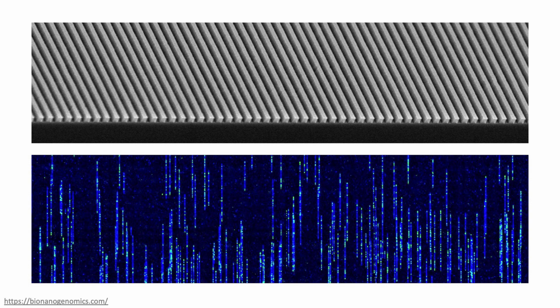And the idea here, you will see the blue color is the DNA background, and the green color is similar to what the cytogenetic bands look like. So it's a very specific region. The difference between it and cytogenetics is that cytogenetics looks at a huge segment, while here the resolution is up to 500 base pairs, which is amazing resolution.